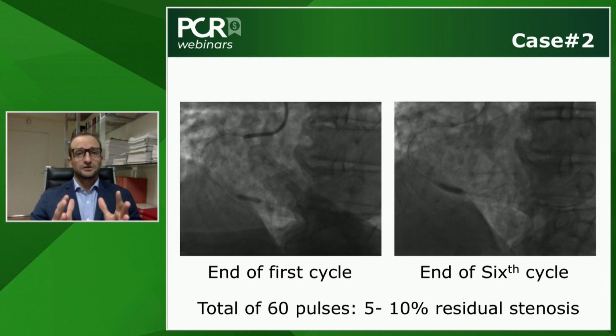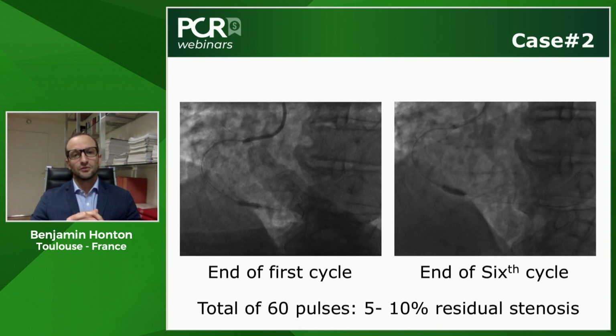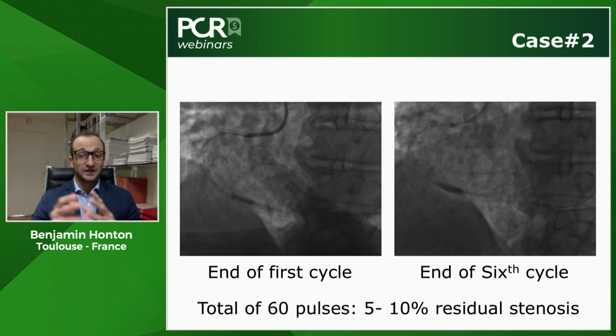No, quite surprisingly, I didn't have any friction despite the tortuosity and the calcification on the mid-RCA. One important tip and trick: you have to avoid twisting of the buddy wire to improve the deliverability of the catheter. But you know that the crossing profile is nearly 0.042 inch for the IVL catheter. But you can see in this case, in this particularly challenging anatomy, that with a simple buddy wire technique, you have quite easy delivery of the catheter. That's indeed a nice demonstration.